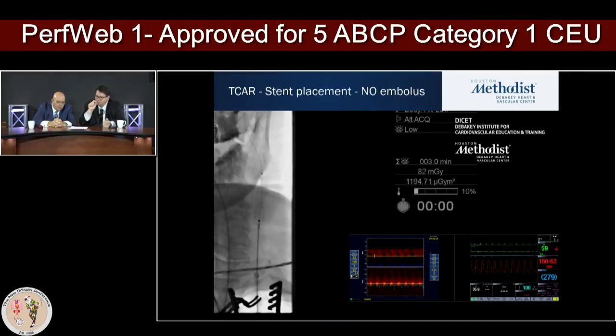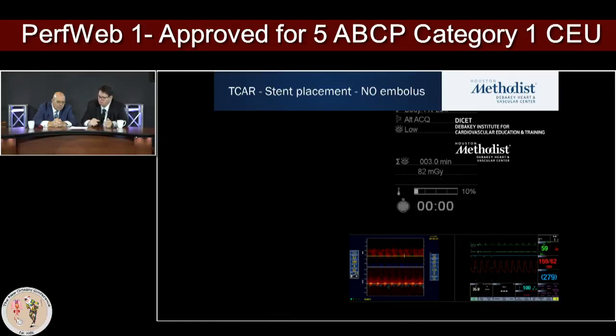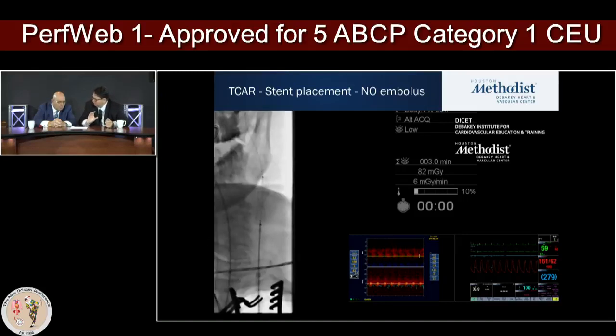It means, with this really sensitive toy of TCD, which picks up everything, you're telling me that I can deploy a stent without a single embolus going to the brain? I'm not a marketing guy, but definitely this is the protection I want in my brain if I need a stenting someday.